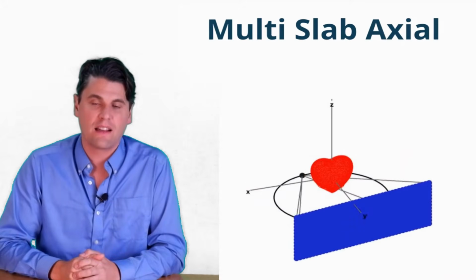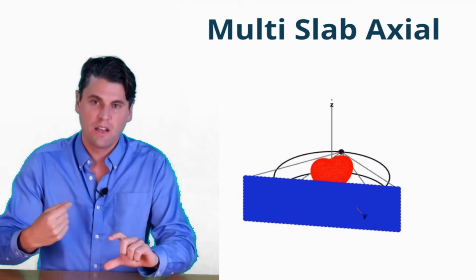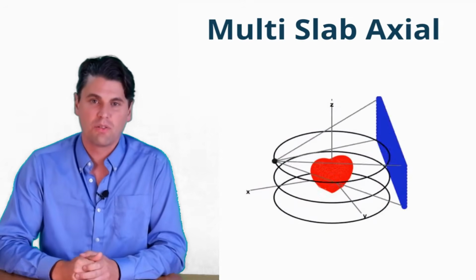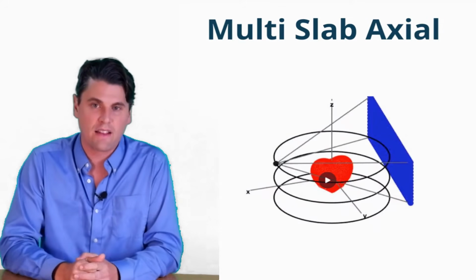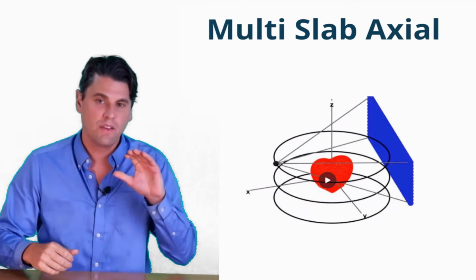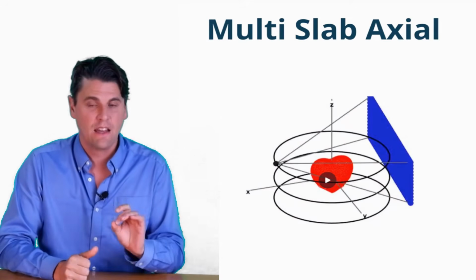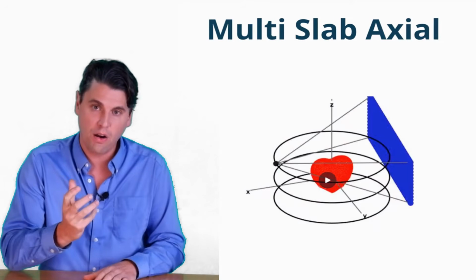Multi-slab axial was introduced next, and in multi-slab axial, the idea is that you would go around the patient and you could potentially scan the heart in a series of 3 axial acquisitions. So this is called usually 3-beat cardiac. Sometimes it would take 4 beats depending on the coverage of those axial slabs. But the idea here is that you could save radiation dose because in the case of helical, that was very low pitch. And because we are looking at prioritizing the gating, we're actually going to not be using the data that's far away from that given heartbeat.